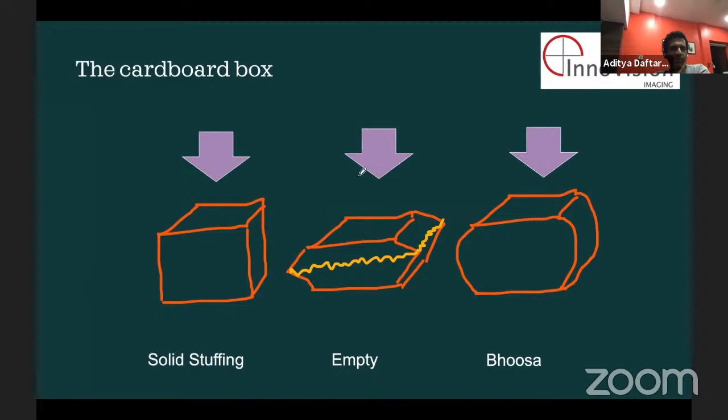When you think of a normal vertebral body, it's like getting a box from Amazon which is filled with books. It's a nice, strong box. If you sat on the box, nothing would happen. If you took all the books out of the box, then you're looking at an osteoporotic vertebral body. If you sat on top of that box, the box collapses, basically with angulation. The sides of the box just angulate, so you see angulated areas, and that's what you call retropulsion per se.